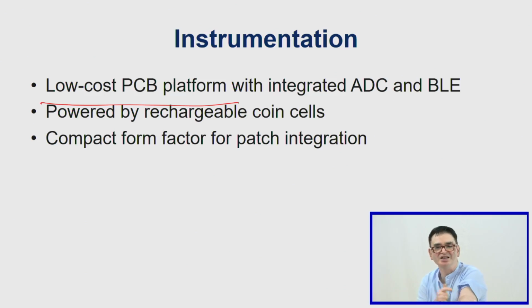And these guys can learn from us. How can they learn from us? They can start using the same sensors, and they can start doing multi-analyte sensing. They can't do multi-analyte sensing with this format. You may need a wire which will have different parts functionalized with different materials, but that's going to be hard. So you may need 2 filaments, or you may need 3 filaments. How can they do multi-analyte sensing? That's going to be an interesting problem for them to solve. So with the digital twin, you can learn from each other. All right, so that's your instrumentation side of things.